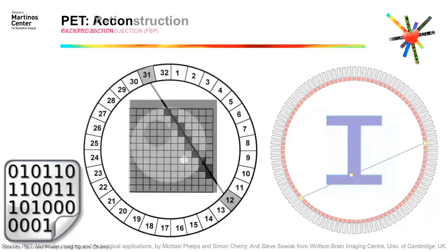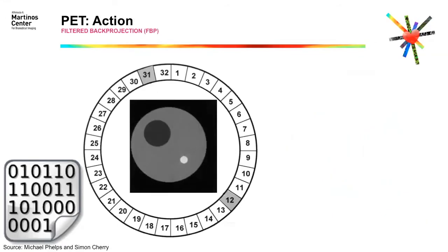So let's suppose that instead of my letter I have more of a brain type of image. Obviously it's not a brain, but a similar type of shape with a couple of structures that could be, for instance, brain tumors. Yes, this is what is inside the scanner.